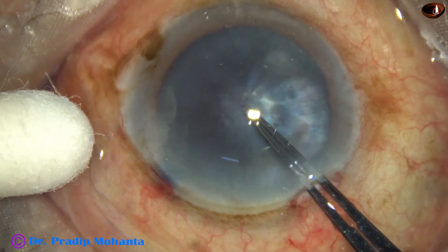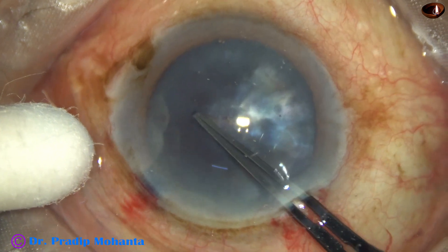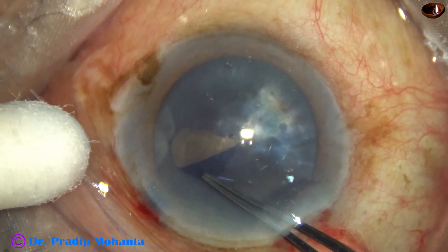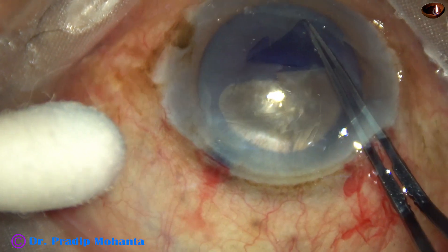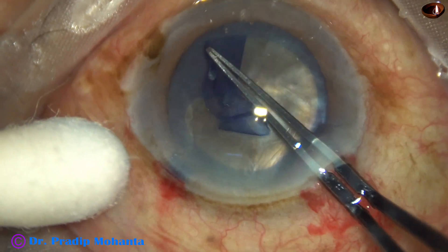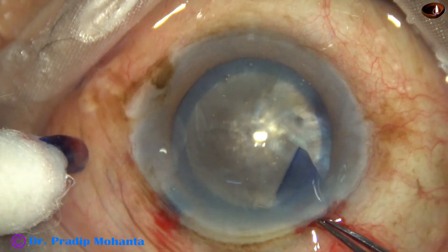I'm using a Utrata forceps — pierce the capsule at the center, go towards 3 o'clock, hold one side of the capsule, and now go anti-clockwise all around to get a large rhexis. The size of this rhexis is about 6 millimeters.